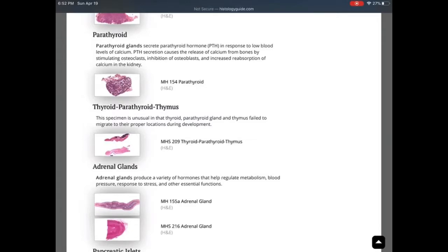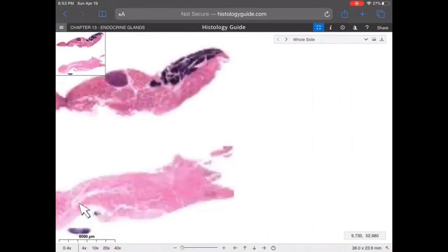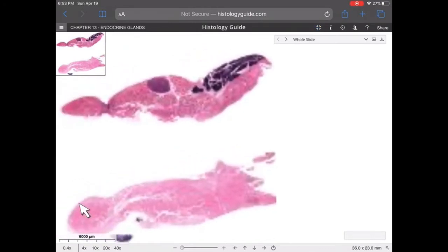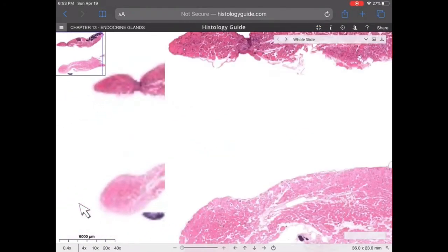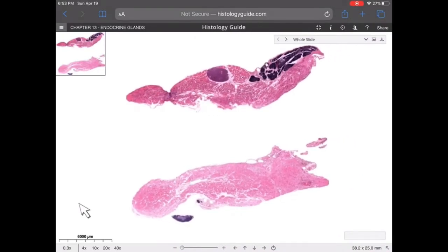The reason for that is that your lab slides, if you were to take 242 in person, also sometimes have hunks of thymus on them. So I'm going to show it to you just so that you can know that that's not what you're looking for. That's not that unusual, actually. So we have a bunch of slides that are like that. So let us collapse this. And then I'm going to wait for this to figure itself out. There we go. Okay, so I'm going to pick this.